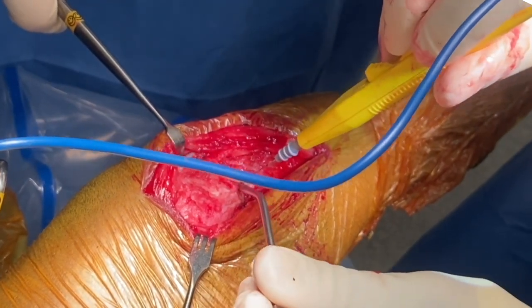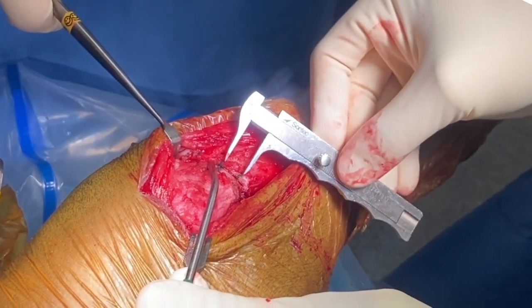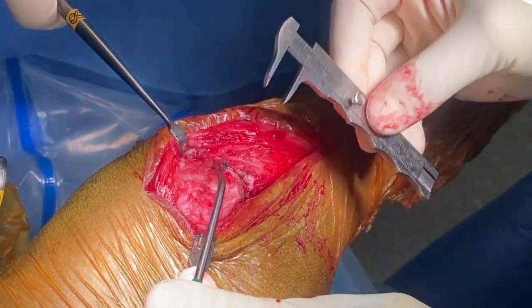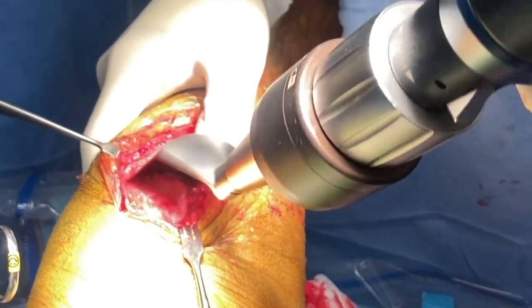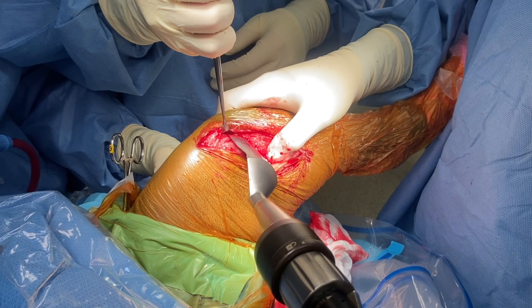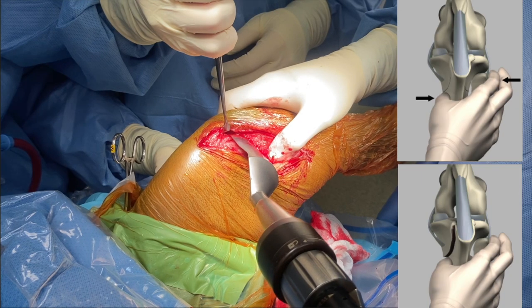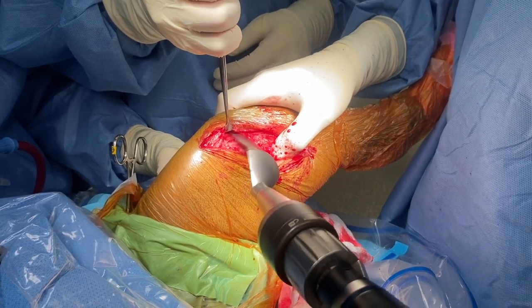The distance between the marks is checked. The saw is placed into the osteotomy; my preference is to have the sagittal plane vertical with the tibia parallel to the floor. The saw is oriented horizontal and perpendicular to the long axis of the tibia. The hand supporting the tibia is positioned so that the index finger is pushing on the fibular head and the thumb is pushing against the medial cortex under the tibia. The osteotomy is completed with judicious blade rotation and lavage.